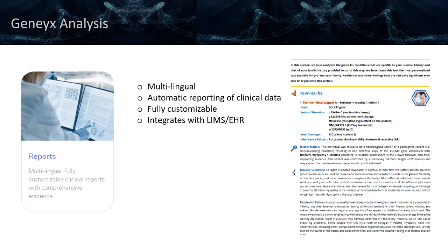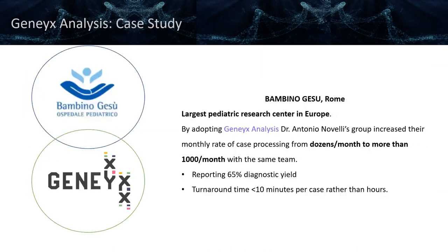And so with that introduction, what I wanted to do is change gears a little bit and talk about some case studies that show the value of the Geneyx Analysis platform. One is by the Bambino Gesù, which is the largest pediatric research center in Europe. Dr. Antonio Novelli's group adopted the Geneyx Analysis platform, and they were able to drastically increase the number of cases that they analyze on a monthly basis.